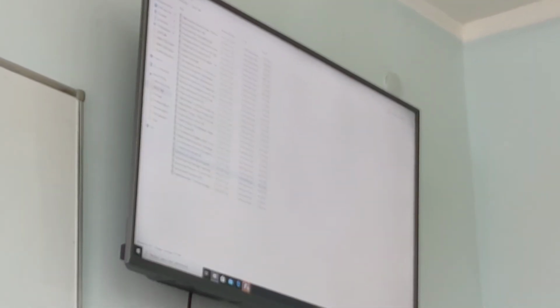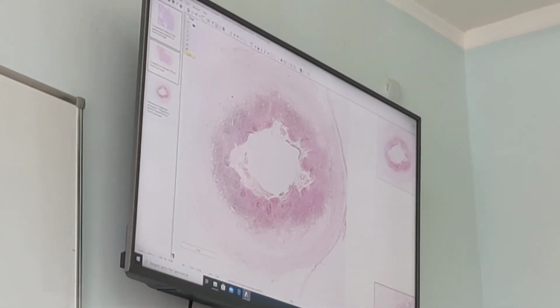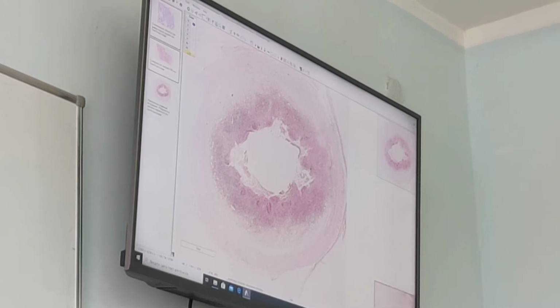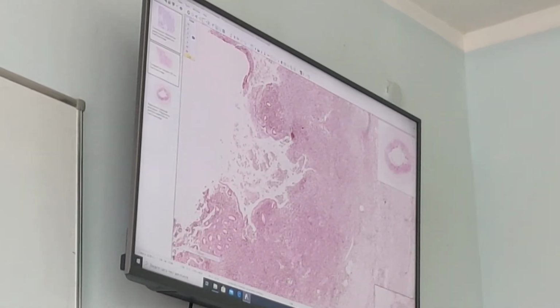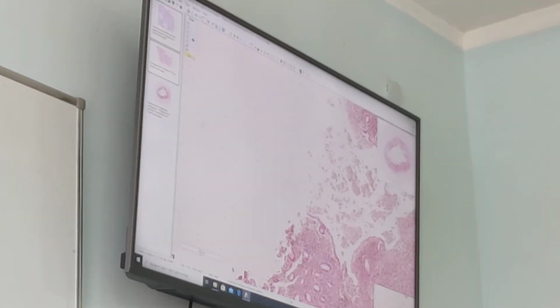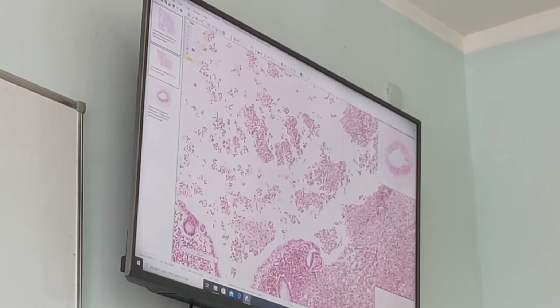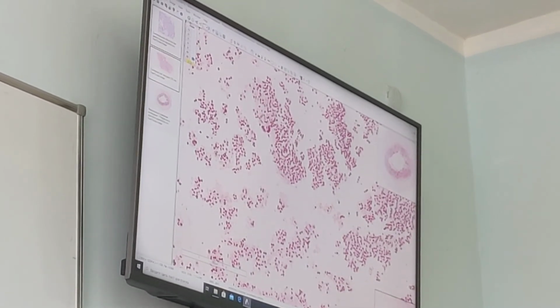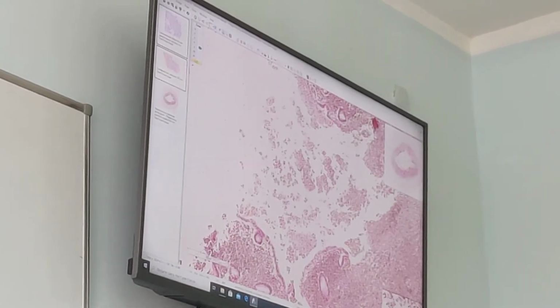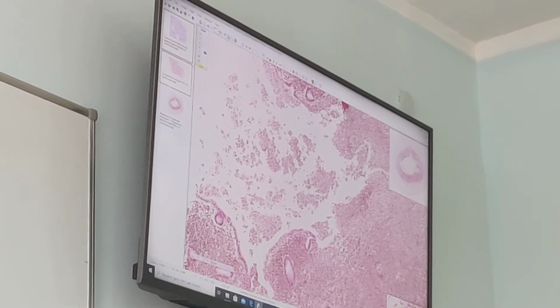Phlegmonous ulcerative appendicitis, inflammation of appendix, hematoxylin eosin stain, mucosa, submucosa, muscular layer, and serous membrane. First of all, go into the lumen of the destroyed appendix: in the lumen, accumulation of pus. In large magnification we can see pus neutrophils. Why is it phlegmonous? Diffuse inflammation which affects all layers of the appendicular wall.